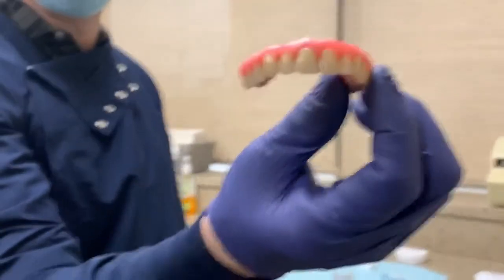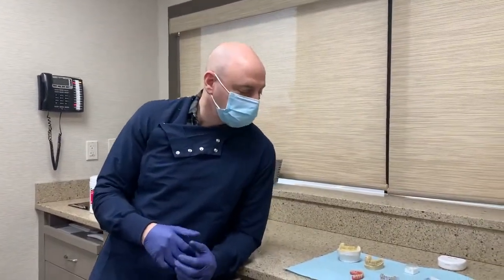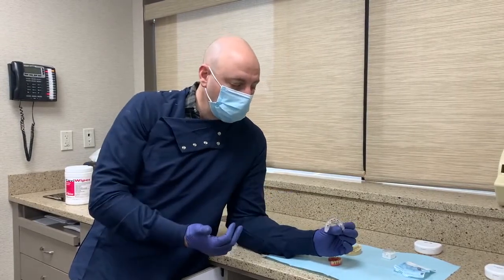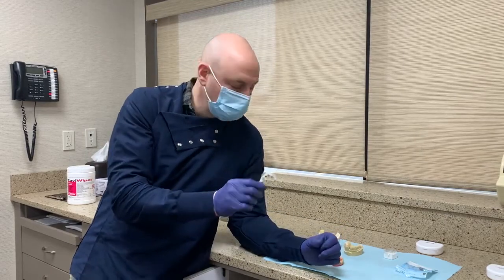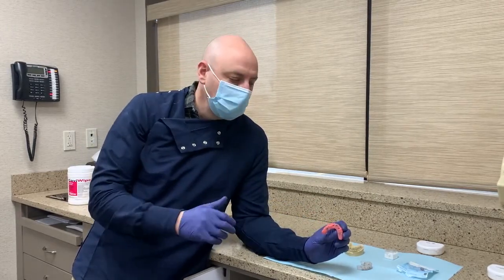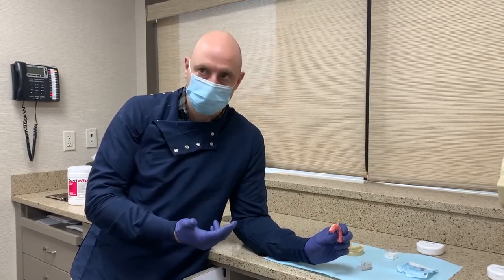Why don't they only do 3 implants on? Well, because we've already confirmed. If you're looking for cast confirmation, we already have that in our pickup and impression. This is the soft tissue impression, registering the position of the implant. So this is the confirmation jig. And when you only are using 3, you get a tripod of stops, so you know it's fully seated, and it just makes it easier and quicker because you only have to screw in and screw out 3.